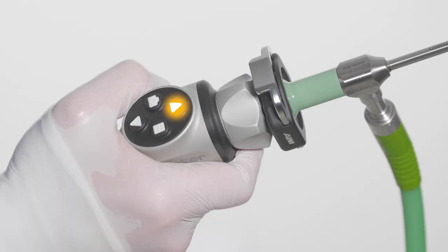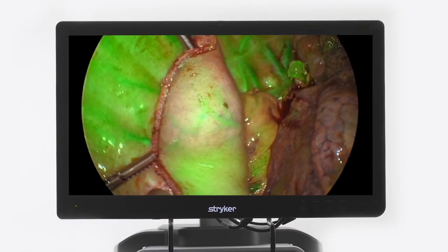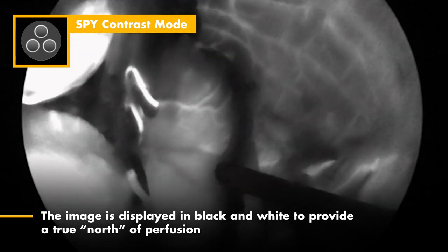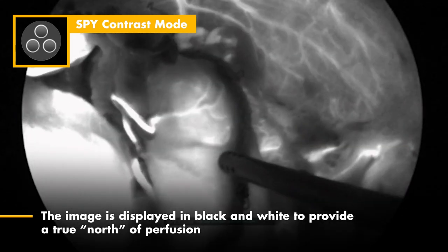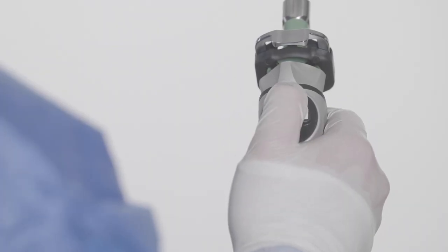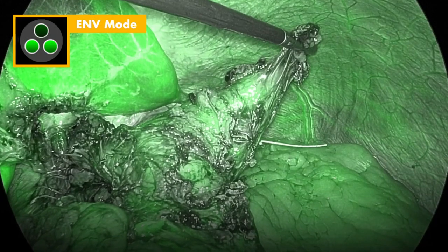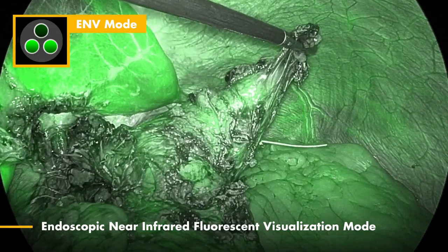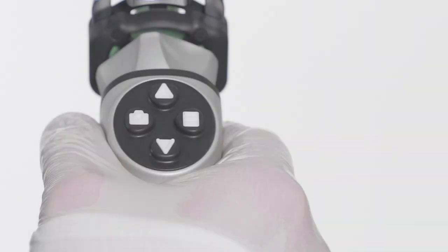Press the up arrow to cycle to the next display mode. In contrast mode, fluorescence displays in white while non-fluorescent areas remain dark. Contrast mode is a grayscale image with white fluorescence overlay, providing the highest level of contrast. Press the up arrow again to cycle to the next display mode. NV mode is a grayscale image with fluorescence displayed in green. To exit SPY fluorescence modes and go back to the normal 4K white light image, press the menu button on the right side of the camera head.